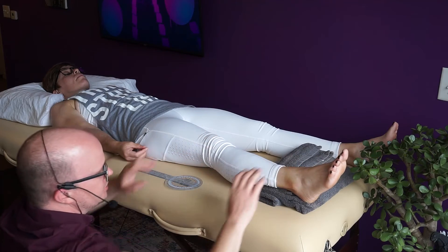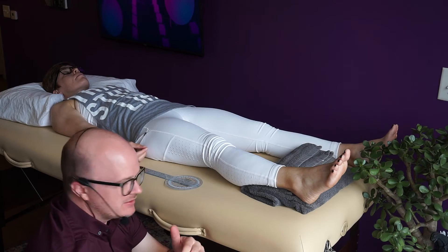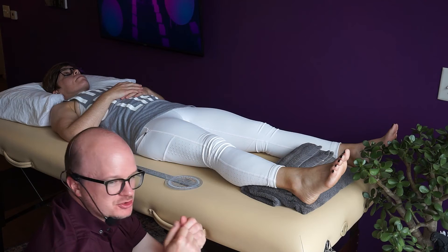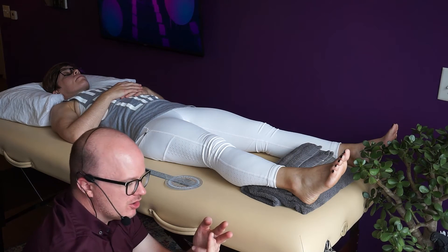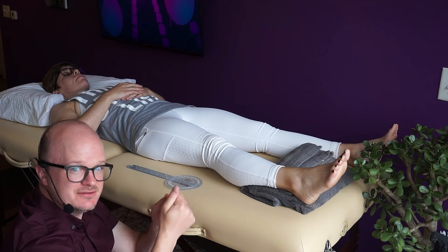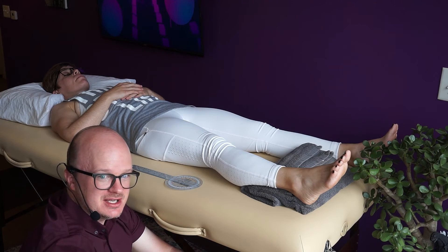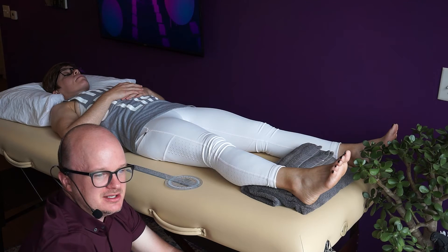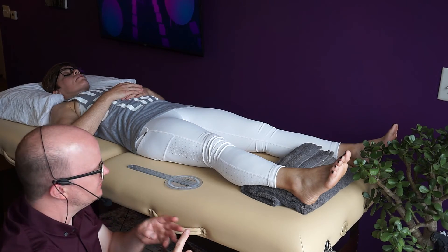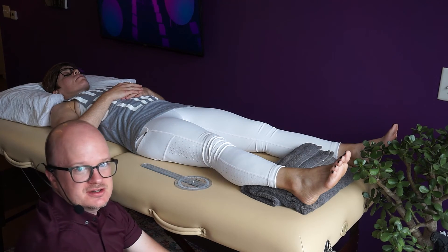Remember, we're looking for end feels on the passive. Active is just whatever the patient can do. Passive is done second, right after the active, and we're trying to find the end feel: soft, firm, hard, or empty. A lot of times students just barely move it — find the end feel. On each practical I'll ask you what the end feel was, and if you say empty I'll ask if there was pain — if not, you didn't push enough. Make sure you're finding the end feel, doing active and passive, and reading the goniometer correctly to give the patient credit for the range of motion they actually have.